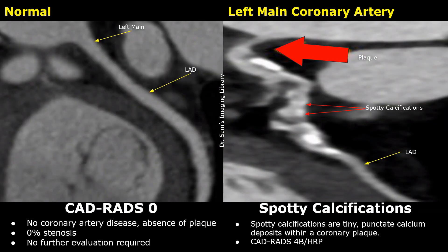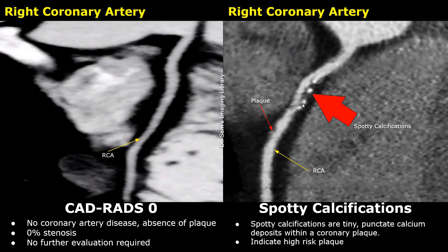We come back to this case we saw earlier. Here we see many small dotted hyperdense calcifications in low-density non-calcified plaques. These are called spotty calcifications and this is another feature of a high-risk plaque. So this case is classified as CADRADS-4B HRP. Here is another case showing multiple tiny punctate calcifications within a low-density plaque. This appearance also indicates a high-risk plaque.